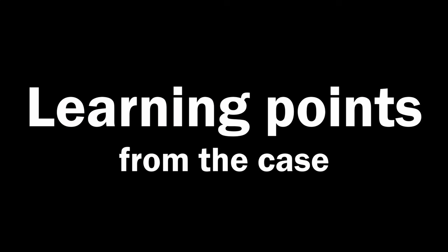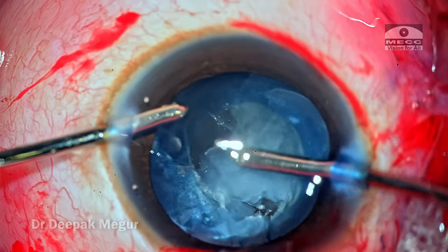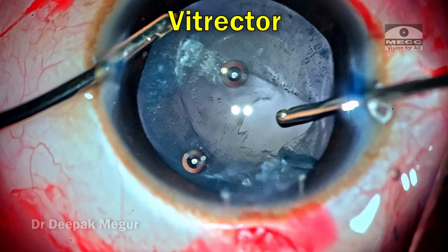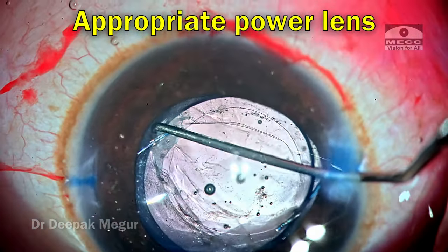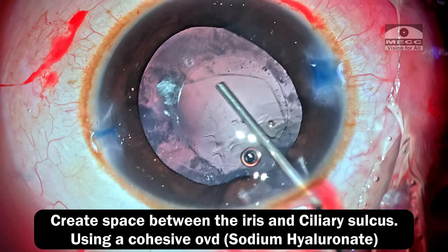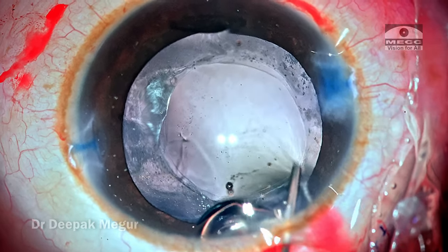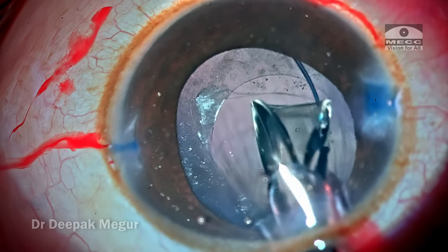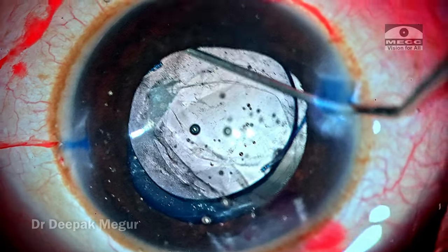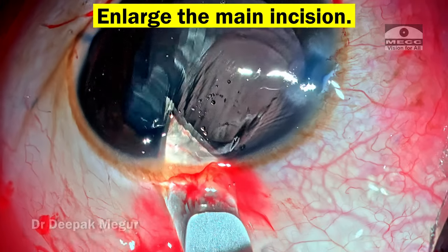A few key points from this case: Number one, in a child with unilateral cataract, always keep traumatic cataract as a distinct possibility. Number two, anticipate a pre-existing posterior capsular tear and be ready with all necessary equipment like a vitrector and an appropriately powered multi-piece hydrophobic lens. Number three, create space between the iris and the ciliary sulcus using cohesive OVD like sodium hyaluronate — this makes negotiating the haptic into the sulcus easier and avoids the risk of dropping the lens into the vitreous cavity.